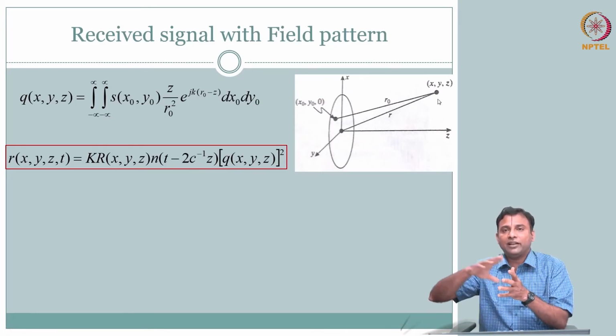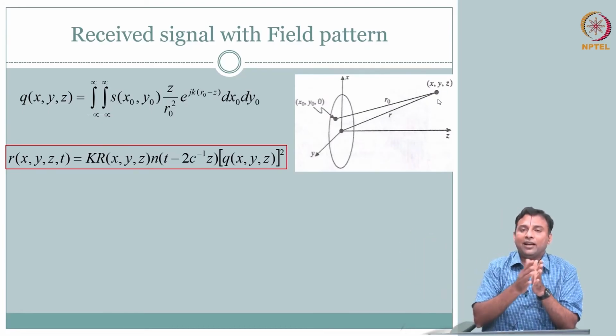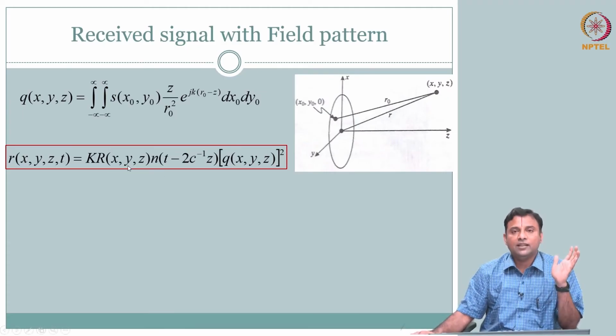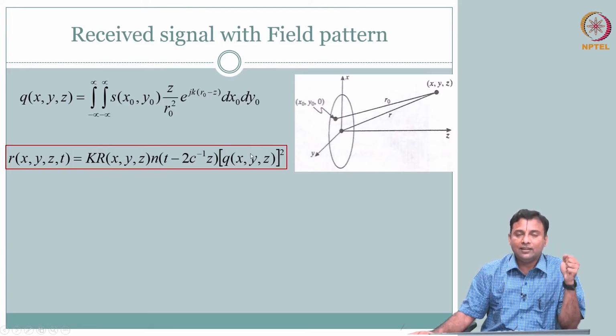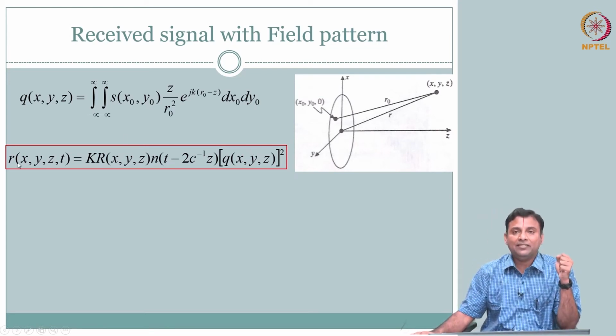So, there is a reflectivity distribution, if you will, and you are collecting back the whole sum of it. That is what this says. How is that distributed? You see it here from all the surface. This is how the shape and size of your transducer gets into the signal that you are sending and the signal that you are receiving.